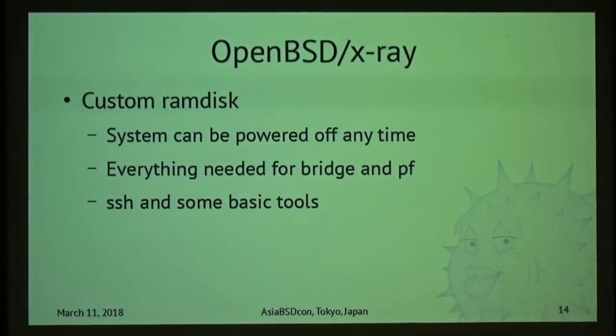The way they use it, they kind of have to. It is a custom RAM disk because these machines can be powered off any time, especially the compact mobile units. They might just pull the plug, so there's nothing that shuts down the machine. And as I mentioned, the field engineers that aren't on site all the time anyway, they are X-ray specialists, they're not IT people.